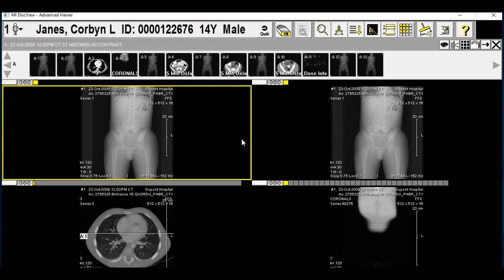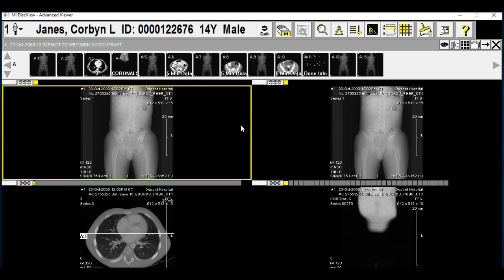I think I had mentioned this before, but CT scans basically take several slices of an image and piece them together. This is my little guy, and this is an abdominal CT with contrast.